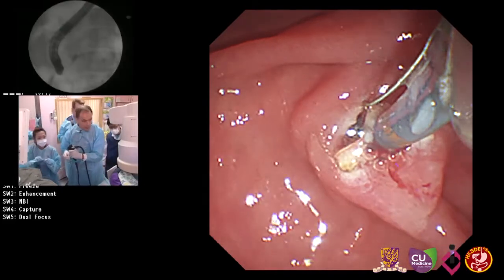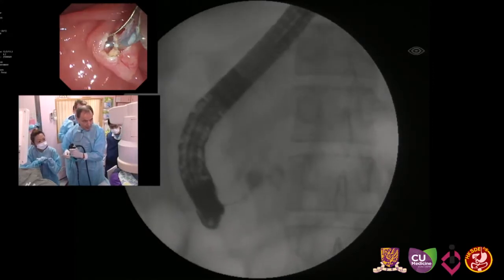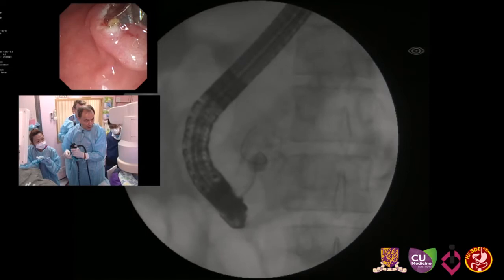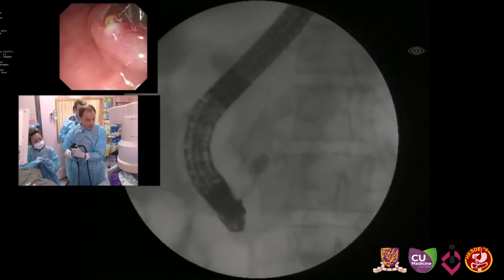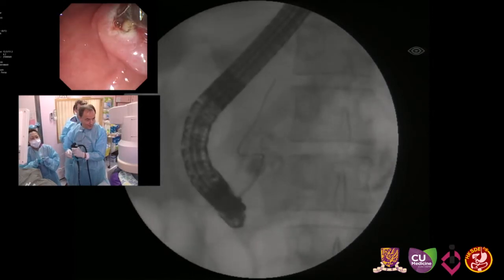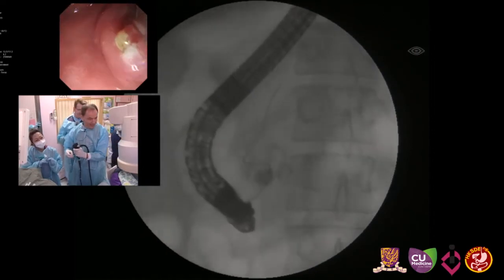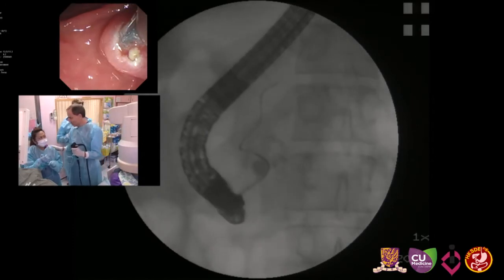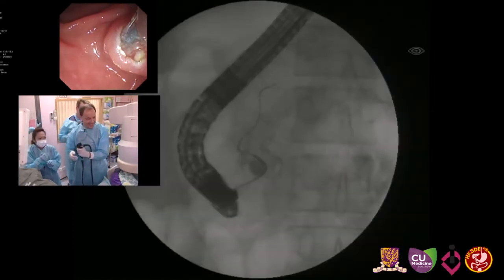Now we see if we can change the position. So with fluoroscopy, pull it back. Yeah, pull it back, and try it again now. Yes. And you see the distance to the stone is shorter. Yes, okay. Should be pancreas. Hopefully this is pancreas. What do you think? Definitely. Okay, inject some contrast. But this is Natalie, so she has the responsibility. Okay, so inject some contrast.